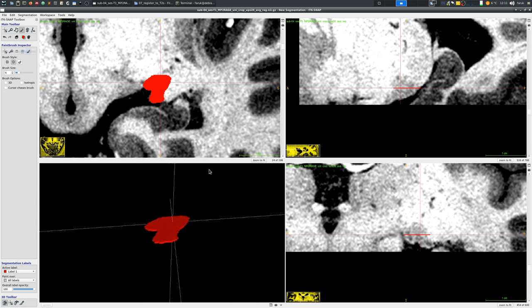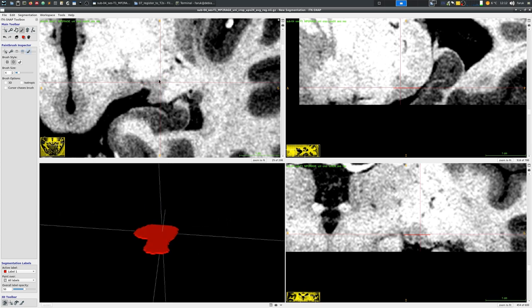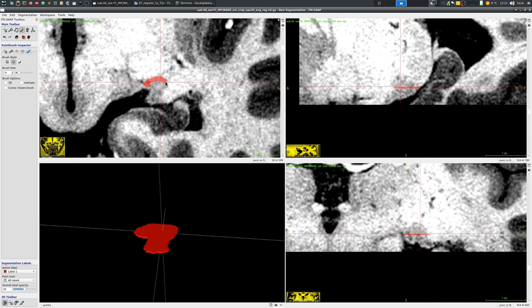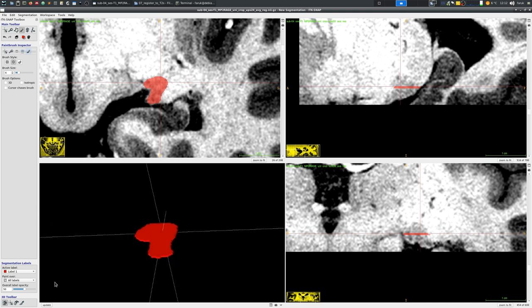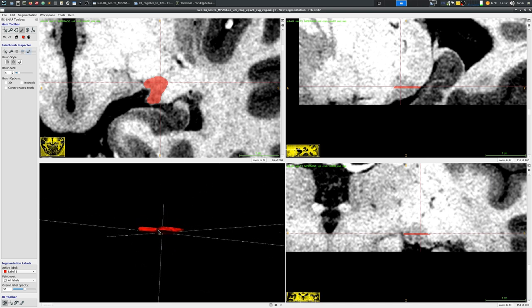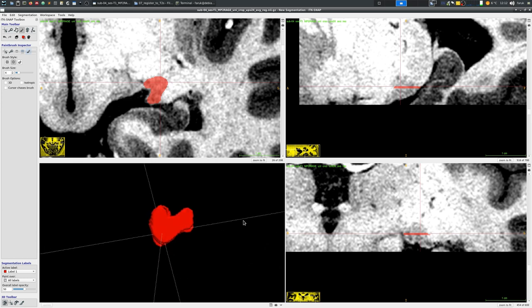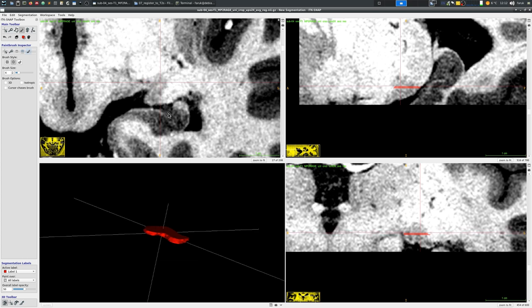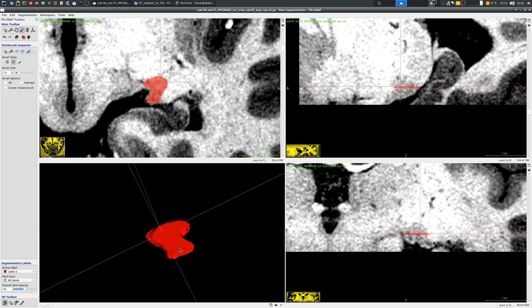This can be quite handy to sometimes navigate yourself and also have a feeling of the overall shape of the structure that you are labeling. Here you see that I went to one higher slice and drawing the LGN around there and one higher drawing again. Now next thing we can do is to update this 3D view and see what has changed. Hopefully you can see that once I have clicked on update it becomes thicker and if you continue doing it it will be more and more looking like a meaningful shape of the LGN.